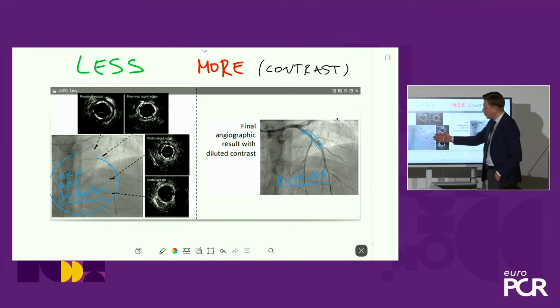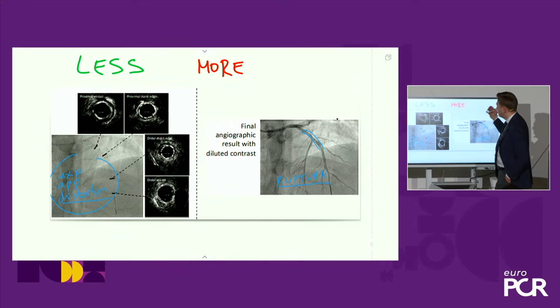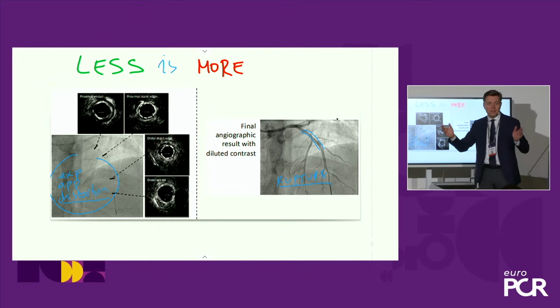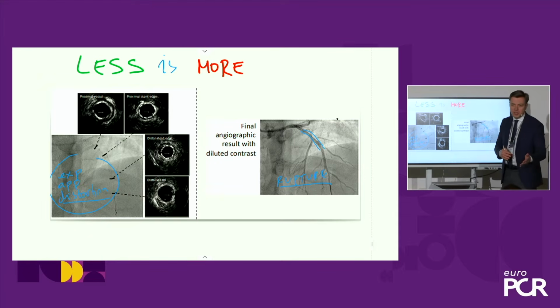So are you going to see more or less if you use less contrast? Actually, if you ask me, less is more. Less contrast is more insight. Because with intracoronary imaging, with this mindset that you do not need contrast, you actually gain more information. We are, of course, all trained. Me personally, I have been trained to use angio only. And as it was said, puff, puff, puff. Let's see it from this angle. Let's see it from that angle. Let's try to see it from here.